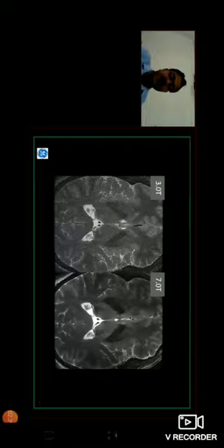It's important for the operator, whether radiologist or technologist, to have good knowledge of these parameters to obtain very good image quality, or simply scan parameter optimization. I can say that the goal is to generate an image with good resolution, with acceptable scan time, and without any artifacts.